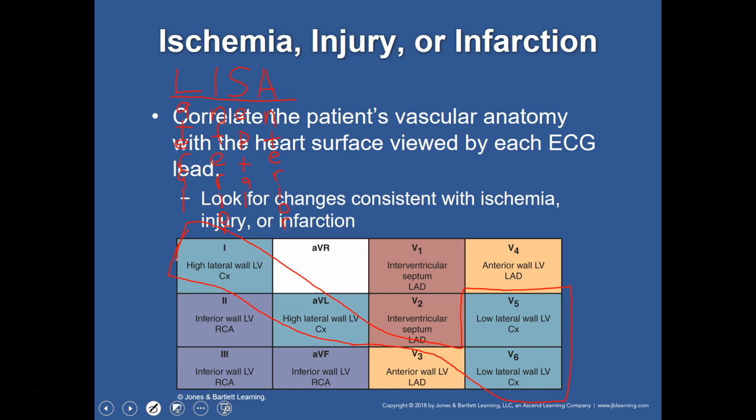Now, in a weird world, I know I've been told it looks like a pipe. In a weird world, that's an L. Okay? Here's your I. Here's where I mess up. Oh, I think I got it that time. That's kind of a weird I, isn't it? So we got an I. Here's our S. It's just marking which leads are what.